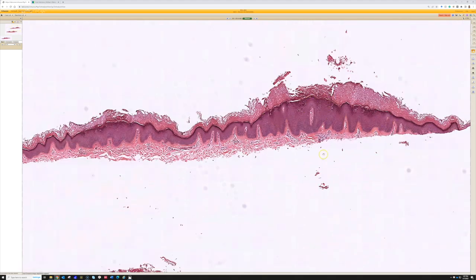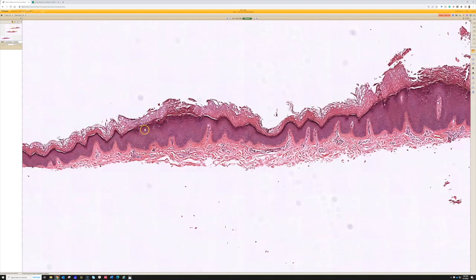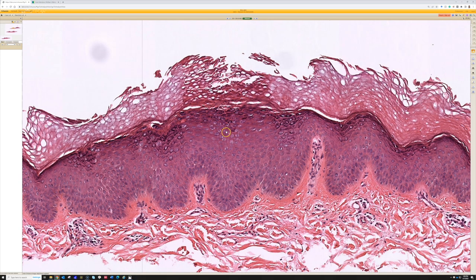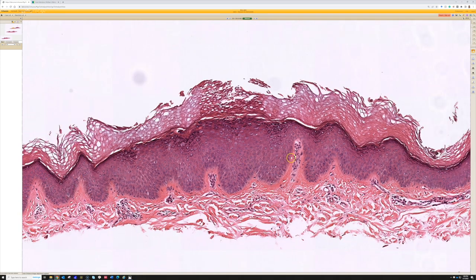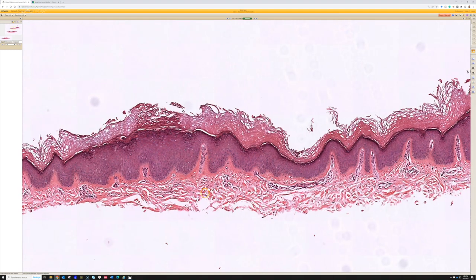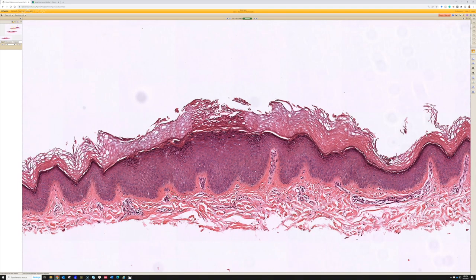On the right there's a nice example, and on the left this is a nice example of how subtle they can be — only very vague thickening, very vague hypergranulosis, subtle little bird's eye koilocytes. On ones like this I'll sometimes say it's suggestive of verruca plana, I'm not a hundred percent sure. I'd rather be honest and say I'm just not certain, especially if I don't have good clinical information, rather than always being black and white.